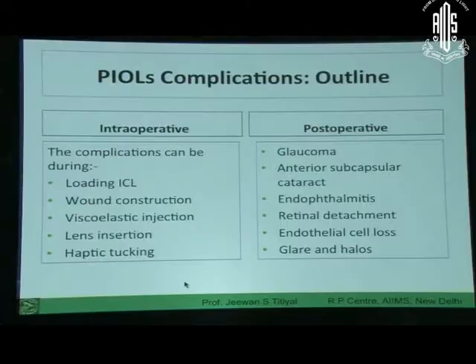I think refractive surgery has seen a sea change in the last 30, 40 years. And looking into phakic IOLs, as he rightly said, is a concern for many, many patients. As Purinder talked about, there are various concerns on anatomical parameters of the patient. The complications and problems can be associated with these things.